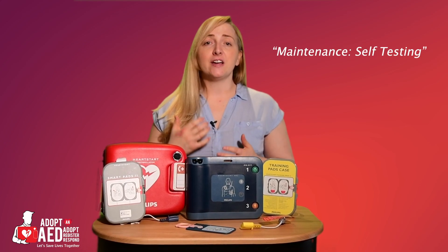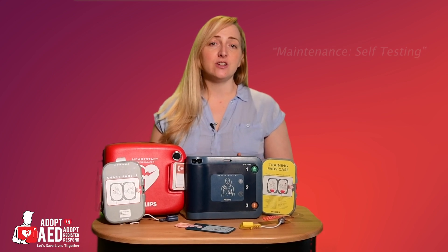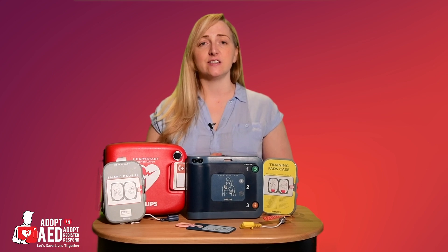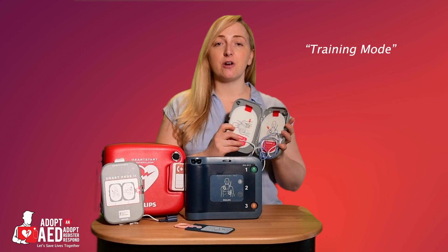The Philips FRX can deliver a shock in under 8 seconds from the last compression on the chest and complies with the UK resuscitation guidelines.